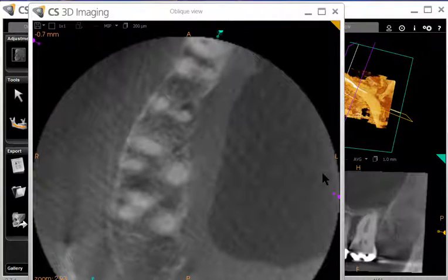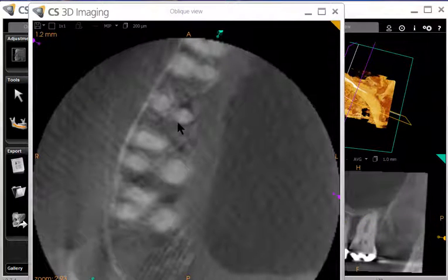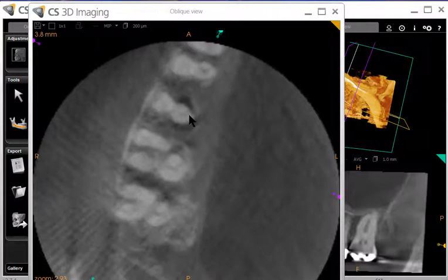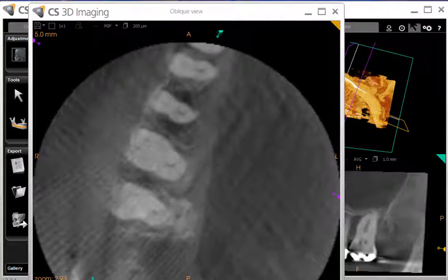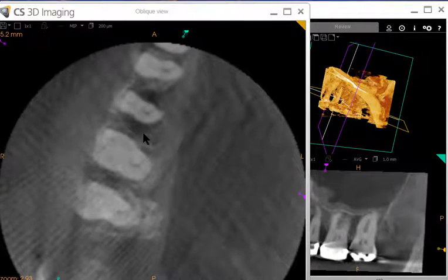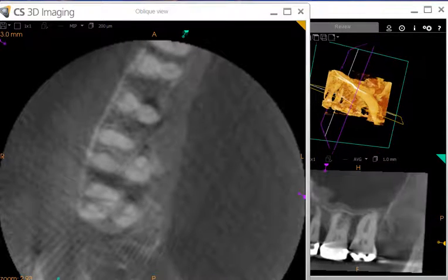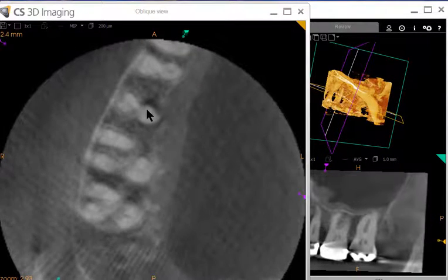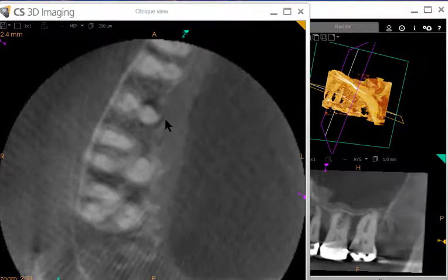Now let's concentrate on the axial slice first — it's parallel with the floor, so I'm going to move it up and down. As I do that, I want you to concentrate on the periphery of the palatal root of this second bicuspid. You can see in the 3D image where that slice is, and here we are pretty much at the crest of bone, now moving apically in the scan.